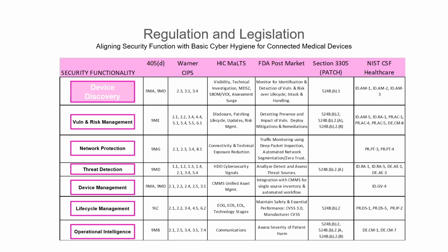And an SBOM, the software bill of materials, has to be given. Just recently, you might have seen that the FDA is not going to exercise refuse to accept. Refuse to accept means I'm not accepting your 510(k) application to bring this device online and be able to sell. I'm not going to refuse it because this is still all new. I only got my new powers in January, and it's only April. I'm going to give you until October to get me your SBOM and show me how you're going to patch. I'm giving you some time. But in October, you're going to have 15 days to solve whatever you didn't do right, and then I'm just going to say no.